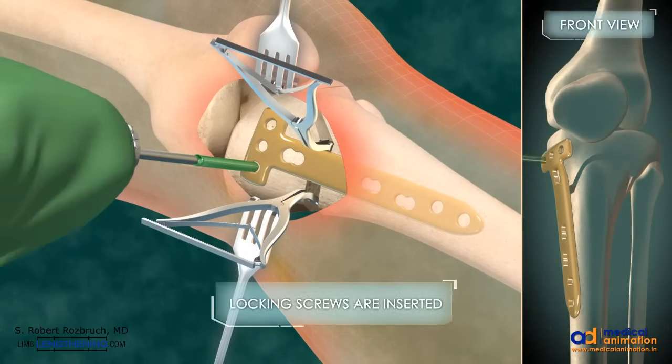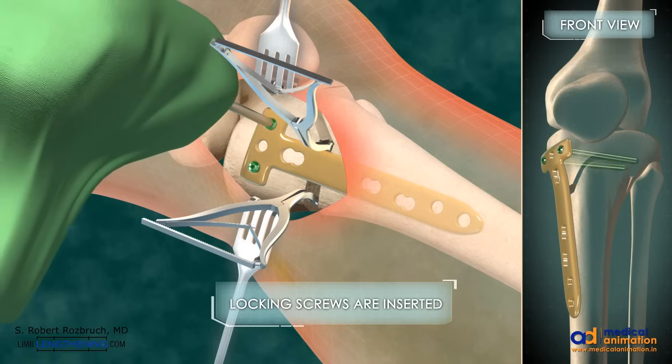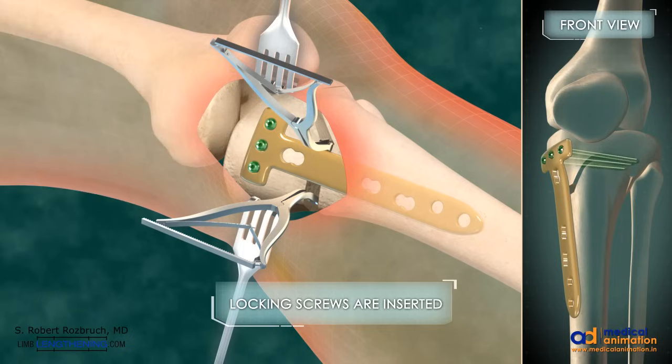Locking screws are then inserted. These are typically five millimeter locking screws placed after drilling with a 4.3 millimeter drill. Typically the proximal segment is stabilized with four locking screws and the distal segment is stabilized with three or four locking screws. This provides a very stable construct to stabilize and maintain the opening wedge correction.